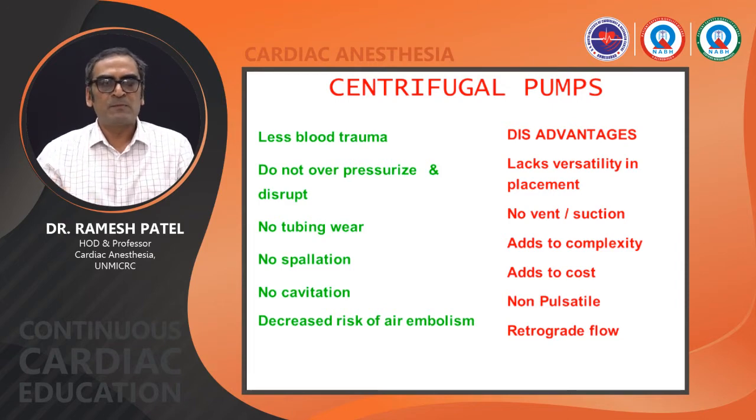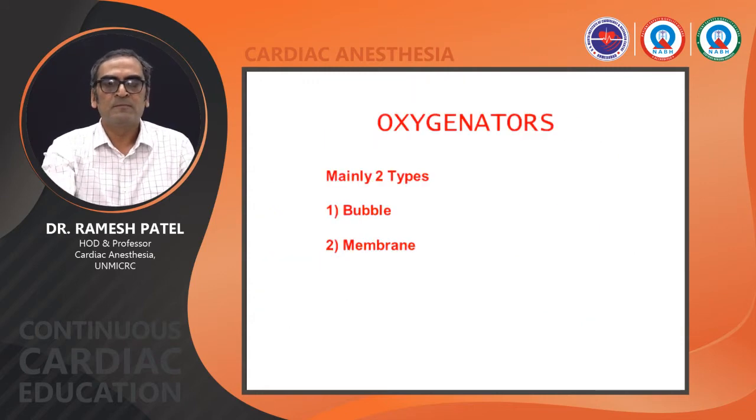Advantages of centrifugal pumps are less blood trauma, they do not overpressurize, no tubing wear, no spallation, no cavitation. But disadvantages are lack of versatility in placement, we cannot apply vent or suction in the centrifugal pumps, no pulsatile flow can be given to the patient, and retrograde flow sometimes occurs if the patient is having very high peripheral vascular resistance.